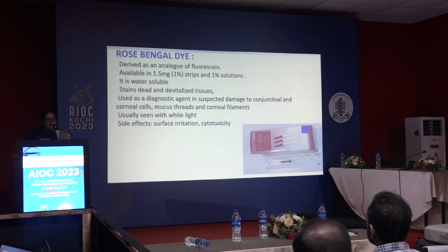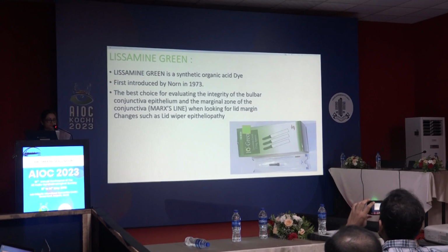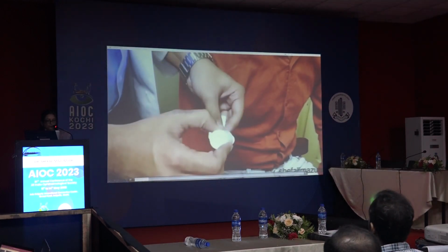But this dye is having so many side effects. So most of the ocular surface surgeons now prefer lissamine green dye over rose Bengal dye. Now, here is a small video showing how you should use fluorescent dye.